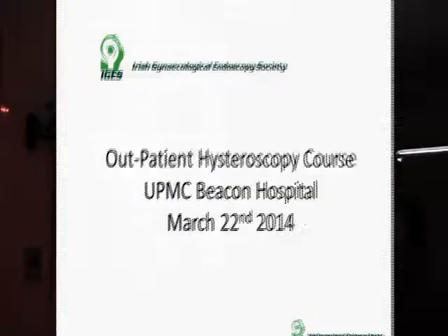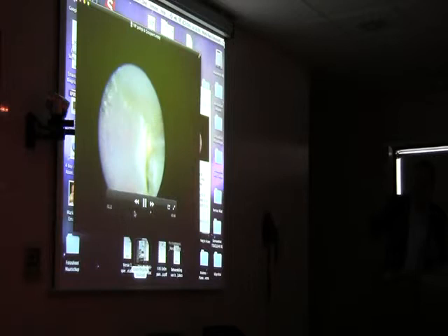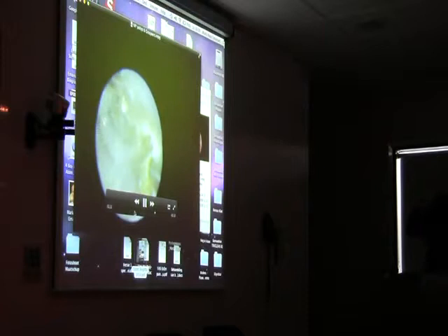Associated with that, we get diagnostic outpatient work and therapeutic outpatient work. So this is an outpatient polypectomy, and this is the most common method we'd employ, which is use of a bipolar electrode, the little VersaPoint electrode. You can cut off polyps, and ones like this are lovely and easy, laterally or anteriorly or posteriorly placed. You get a lovely view.